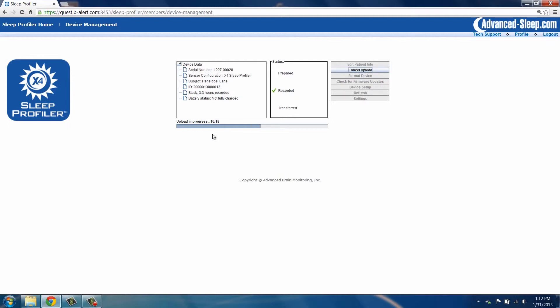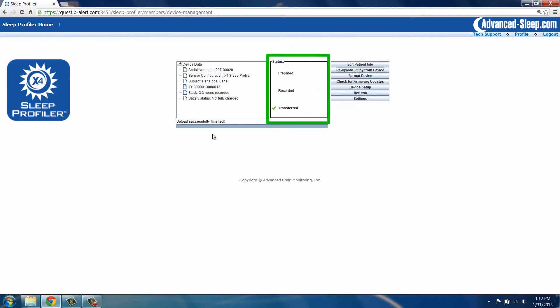The upload will take a few minutes, depending on the speed of your internet connection. Once the progress bar shows Upload Successfully Finished, the device status changes to Transferred. Click Sleep Profiler Home to return to the home page.